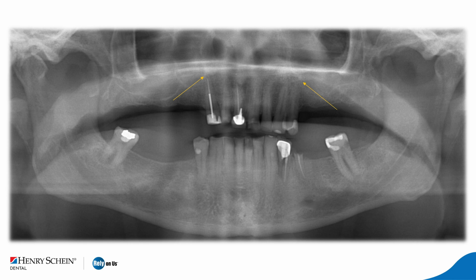Then if you look at the maxilla, and you stay away from looking, okay, this tooth is fractured, obviously needs to be extracted, that crown is broken down, only the root is remaining there. You have to look at all of the anatomical landmarks. And some of those landmarks in the maxilla are especially where is the medial wall of the sinus, especially on the left side. And even though on the right side, it's very difficult to assess.